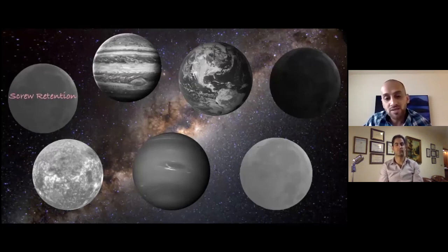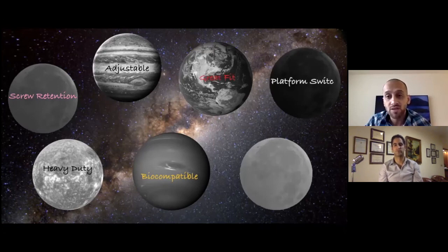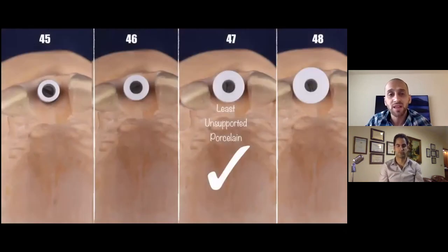So let's just summarize everything that we've talked about. I'm looking for something that's screw-retained. I'm looking for something that's adjustable, that my laboratory technician knows how to adjust. I'm looking for something that's heavy-duty and doesn't break. We're looking for something that's biocompatible, as we have discussed. We're looking for something that gives us a great fit. Looking for an abutment that can allow me to platform switch, and I'm definitely looking for something that's readily available. So these are the abutments that I have spoken to you about recently.